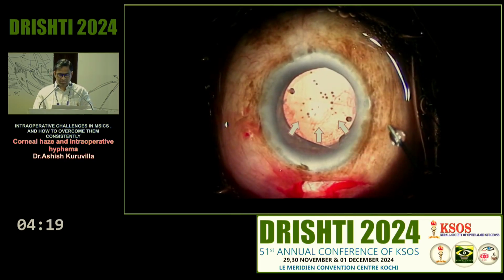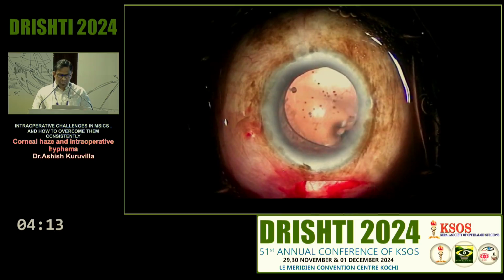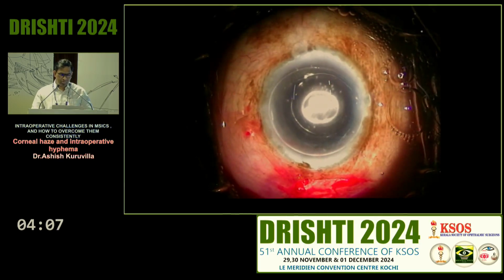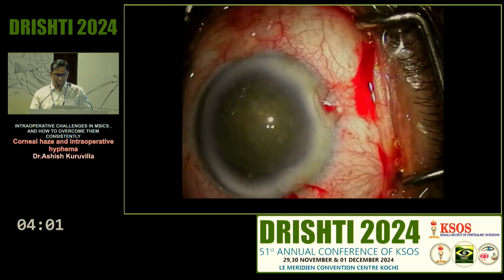So now that the Descemet's is covering the pupillary axis, you will have to correct or rectify that. In this case, since it was a shallow Descemet's detachment, I got away with just putting an air bubble into the AC. I kept the eye, the globe, nice and tight with that air bubble for about 5 minutes, and that was sufficient to rectify this problem in this particular case.